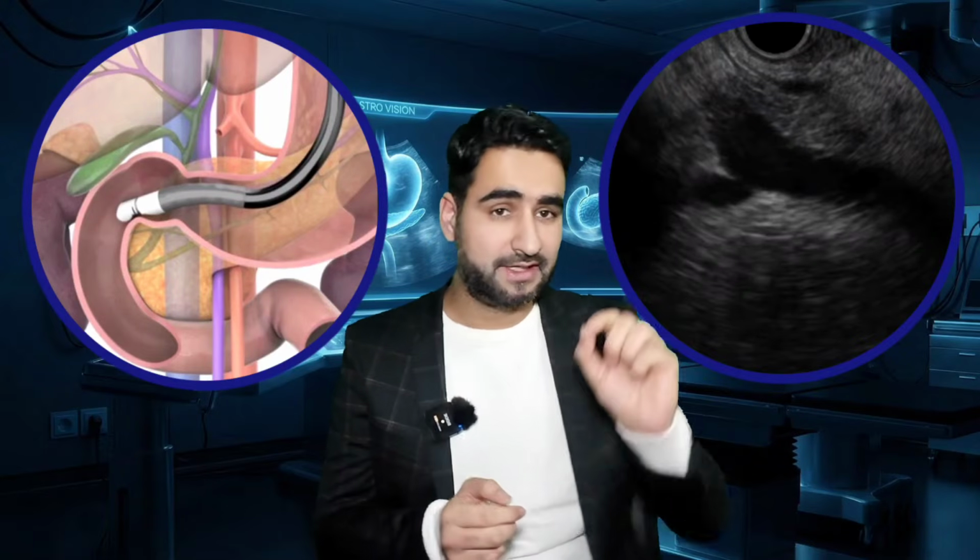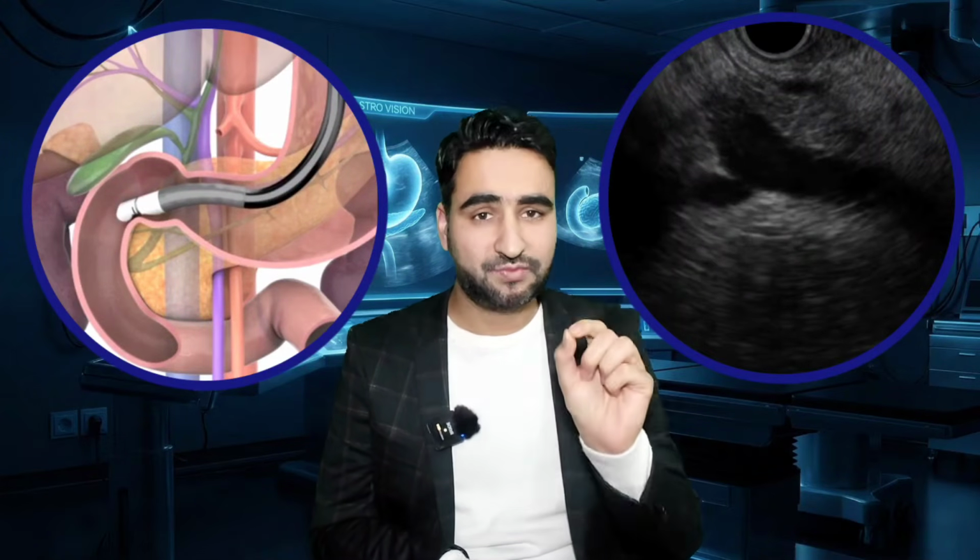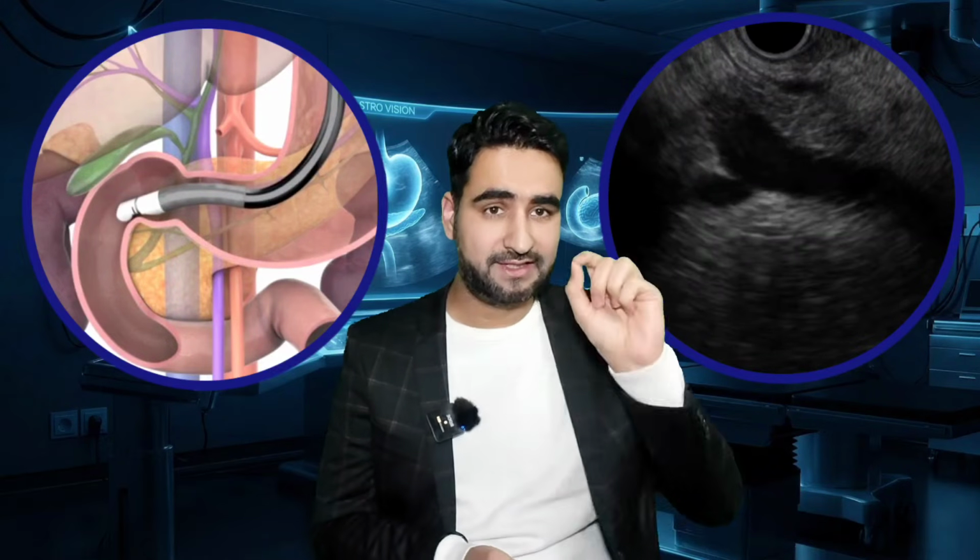At the confluence, look at the arrangement. The portal vein on the left side of the screen, superior mesenteric vein on the right side of the screen. Why this arrangement? The portal vein is in the range of caudal end of the probe. That's why it appears left. While as superior mesenteric vein is in the range of cranial end of the probe. That's why it appears right.